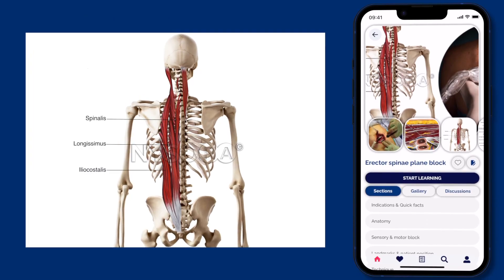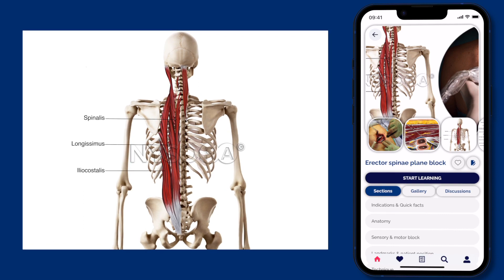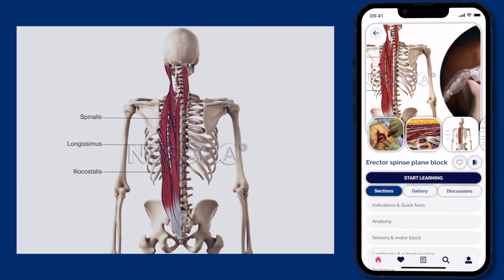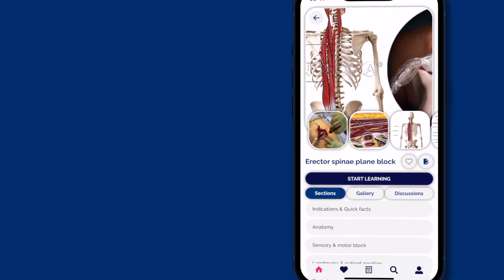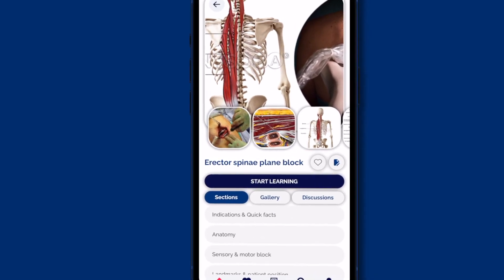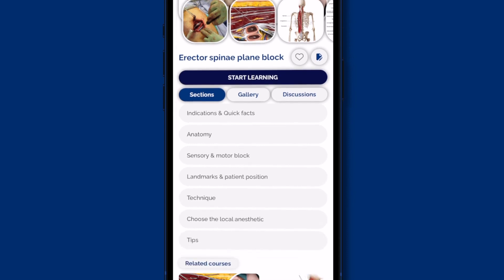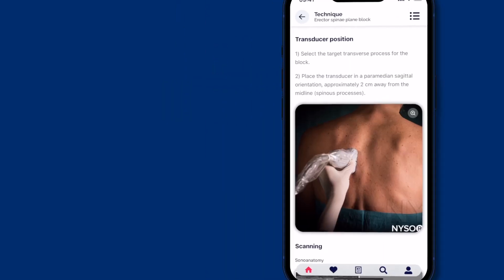Here's how you can use Nysora's NerveBlock app to learn everything about the erector spinae plane block. Let's go through three crucial steps of the technique.